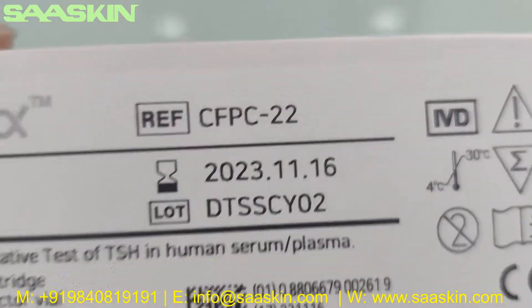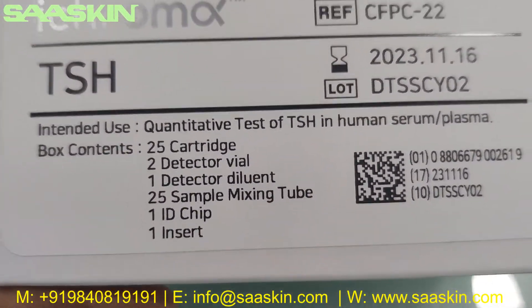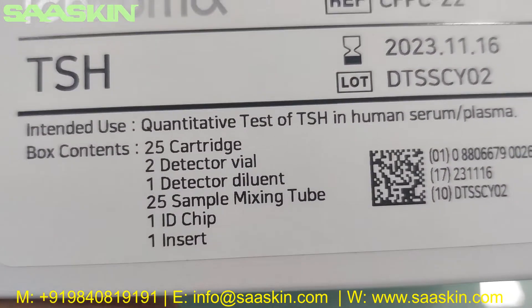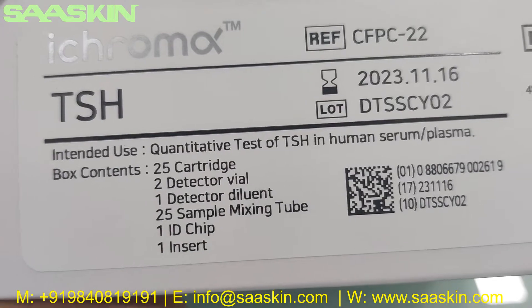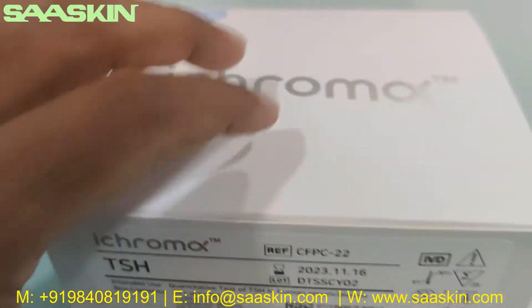You can see the reference part numbers here. Typically, each box contains 25 cartridges, two detector vials, one detector dilution buffer, 25 sample mixing tubes, one ID chip, and one package insert.